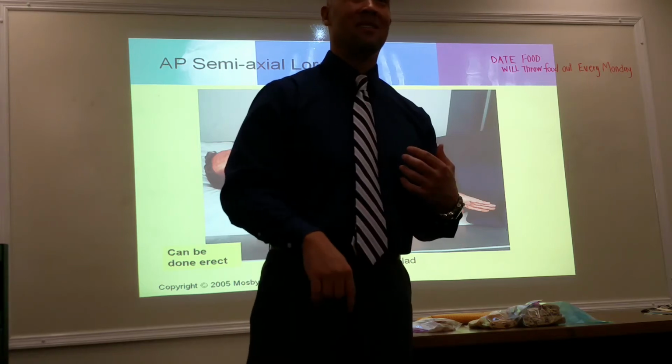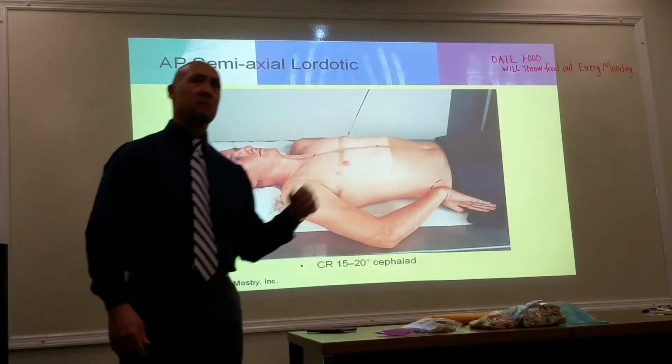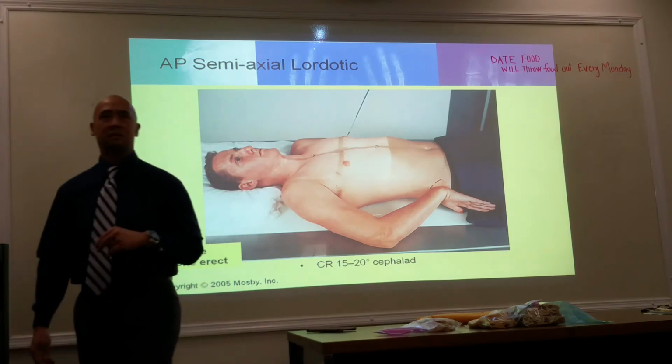You end up doing a repeat. Even eyes are... And the eyes not allowed, yeah, because of the collimation. Because of collimation, nothing for the eyes.